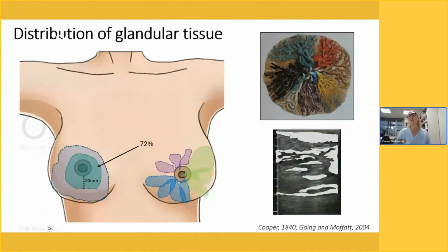You can see here on the ultrasound, the glandular tissue is quite bright, but the adipose tissue in the breast is darker, a darker grey. And I've outlined that and filled it in for you here. So you can see the subcutaneous fat becomes more prevalent and thicker as we move from the nipple out to the areola to the periphery of the breast.